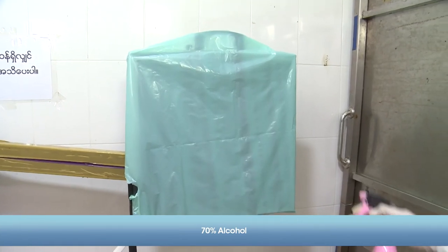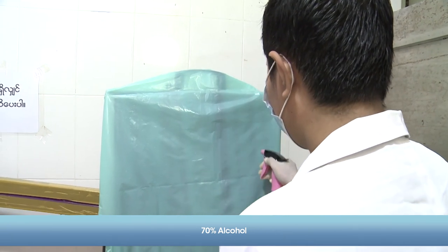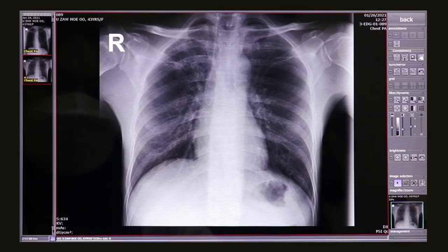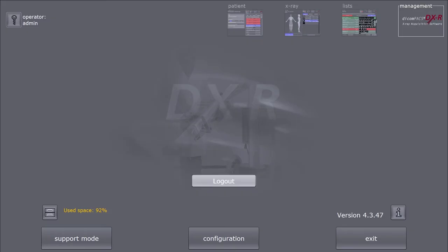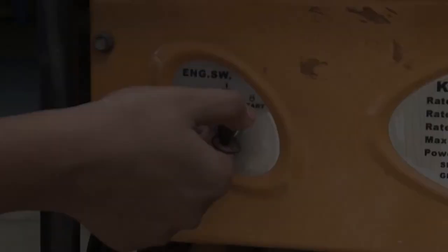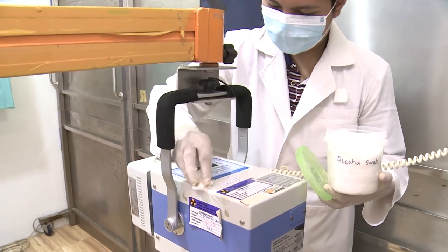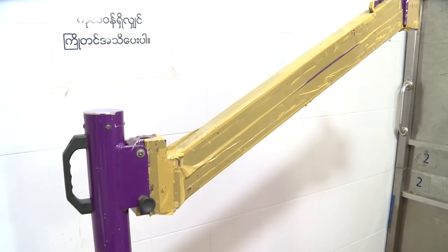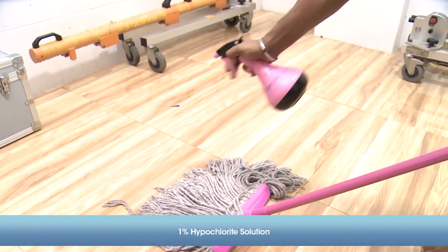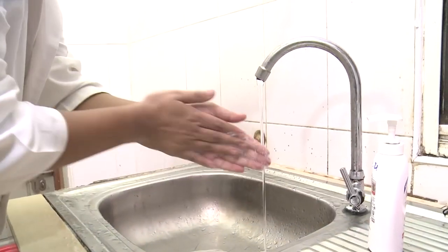To prevent infection, clean the cover sheet on the detector with 70% alcohol after each patient. Check image quality in the imaging software. After all operations, shut down the computer system and generator. Gently clean the x-ray tube, tube stand, and chest stand using an alcohol swab. Pack up all equipment and clean the floor with disinfectant. Wash your hands thoroughly.